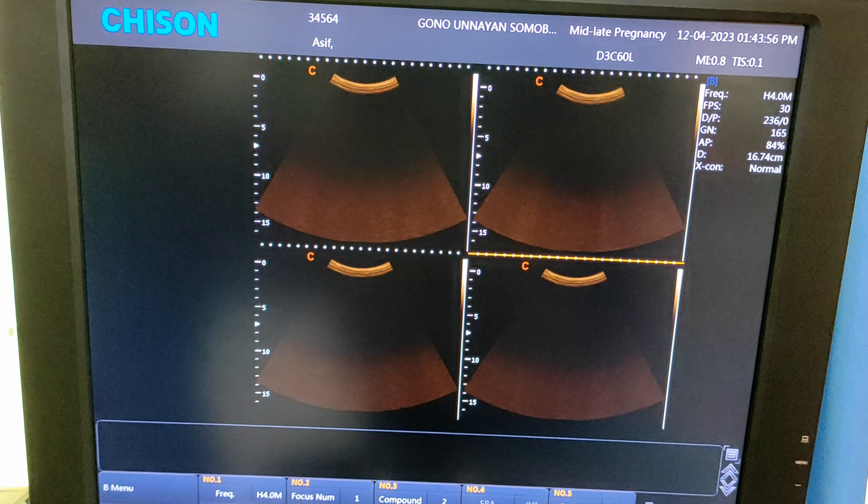This one is the end exam button. If you want to end your exam, just press it — it will take you back to the main screen. It will show you all the information which was examined by this machine previously.